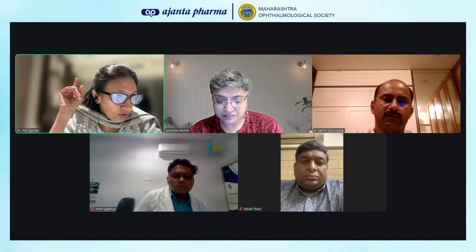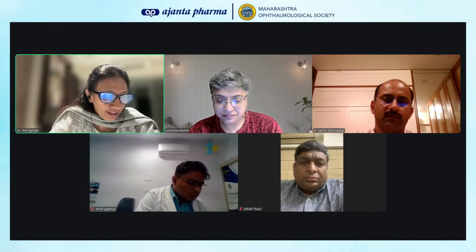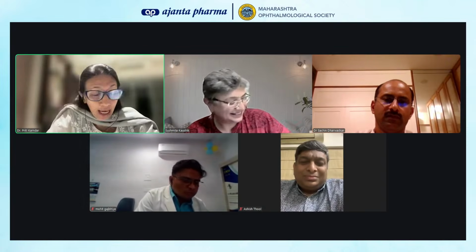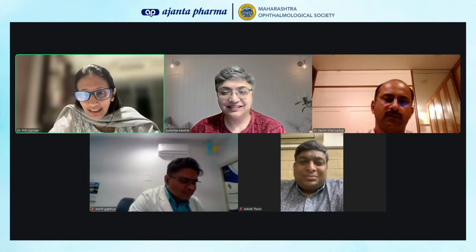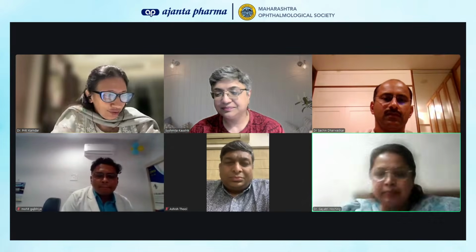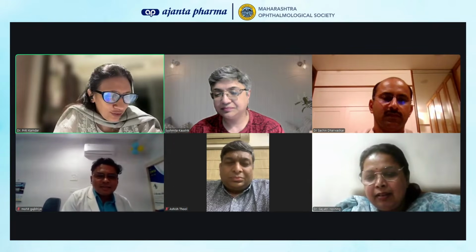There is one question: can we treat a patient only on findings of NCT, or is applanation a must? This is not related to OCT, but this is glaucoma week, so we should be giving you the correct information. Dr. Gayatri, is she there? Because I'm not able to see her. Dr. Gayatri? Yes, ma'am. This question is for you. Can we treat a patient only on findings of NCT?